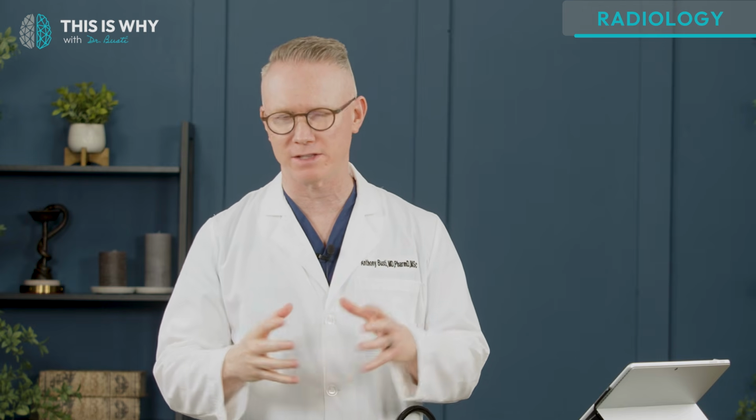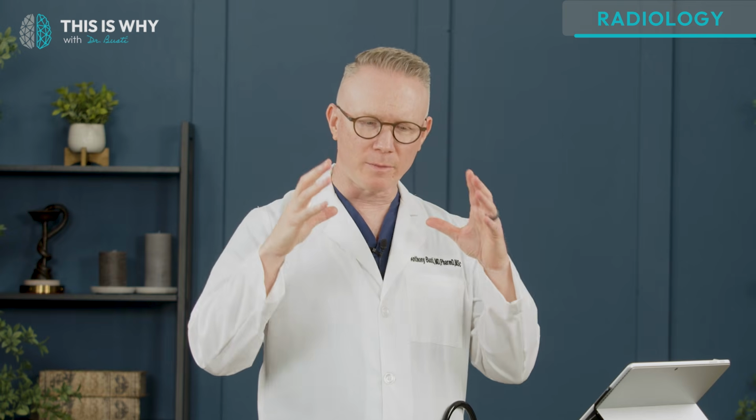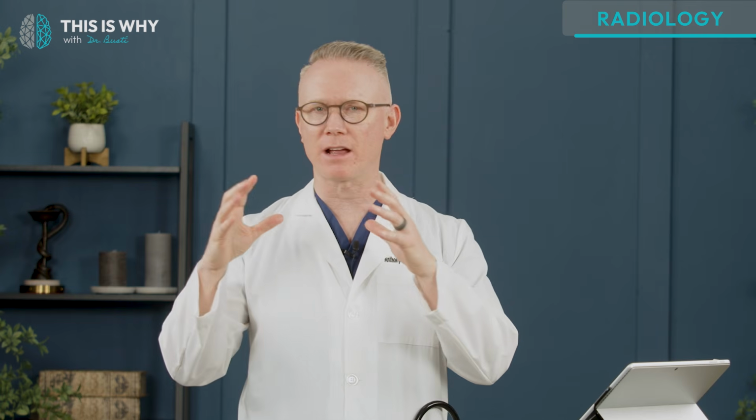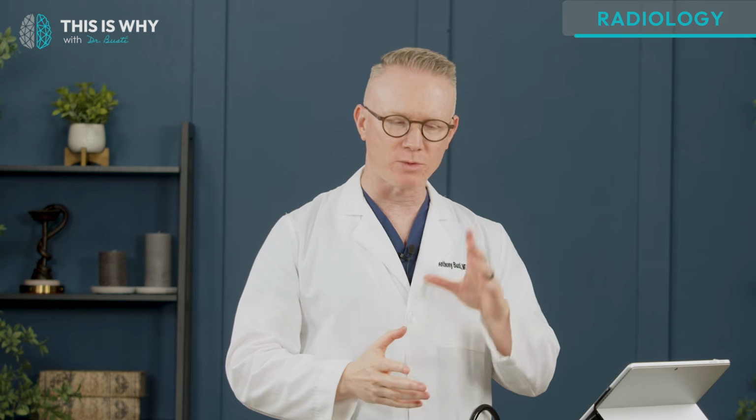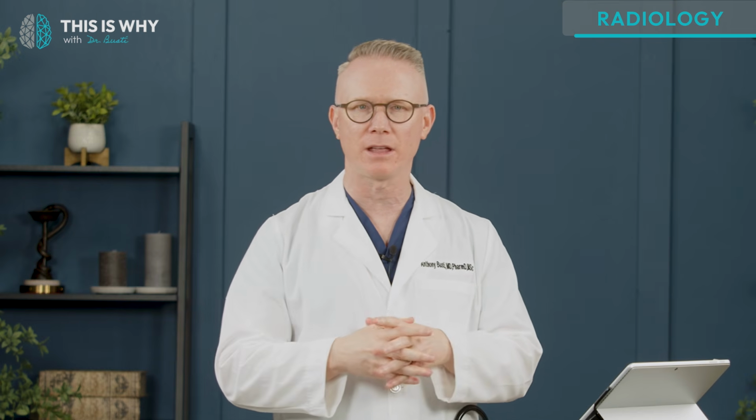So don't be afraid of some of this stuff. Don't get overwhelmed by it. Tackle it, approach it, but use a systematic approach to doing it. And that's why I cover the RIPE mnemonic and use the A to I mnemonic to guide me.